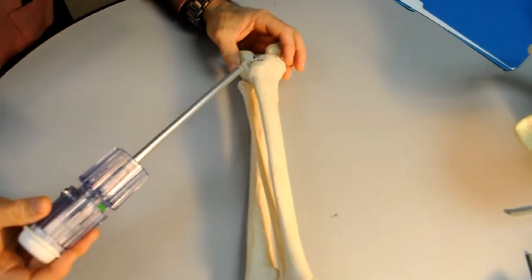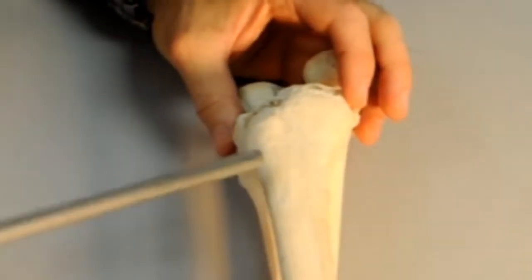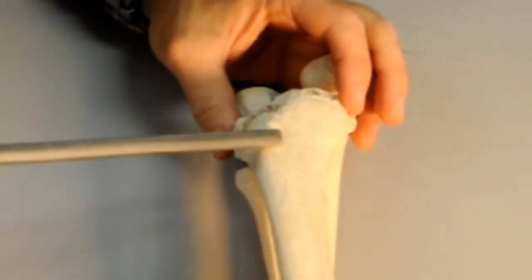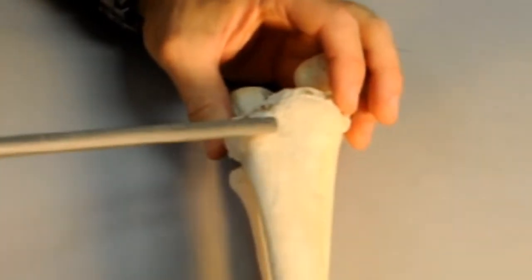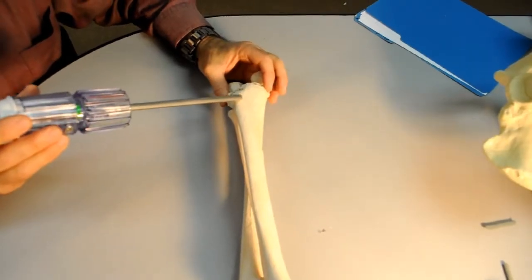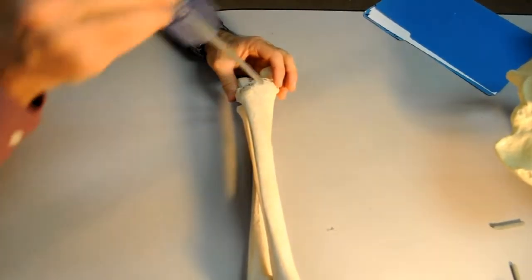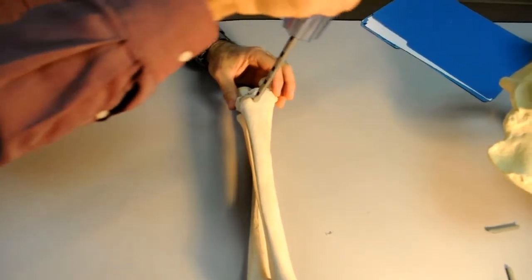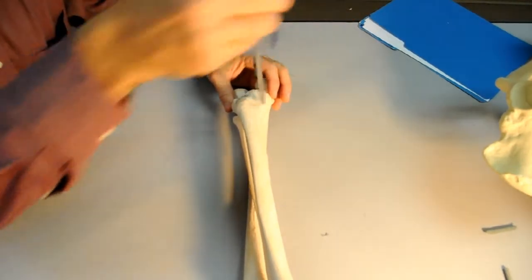In a fully supine patient as opposed to the lateral decubitus patient, I would recommend an incision just medial to the tibial tubercle where one only has to penetrate the skin and minimal subcutaneous tissue before accessing the periosteum. A small cortical periosteal flap, proximally based, can be facilitated with a Kaepner gouge and a small mallet and the device can be introduced at various angles to harvest as much as 15 cubic centimeters of cancellous bone from the proximal tibia.